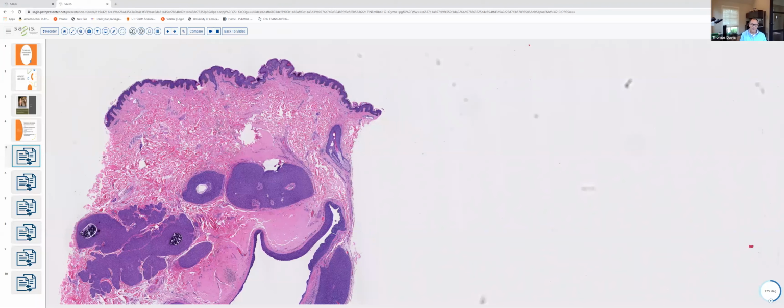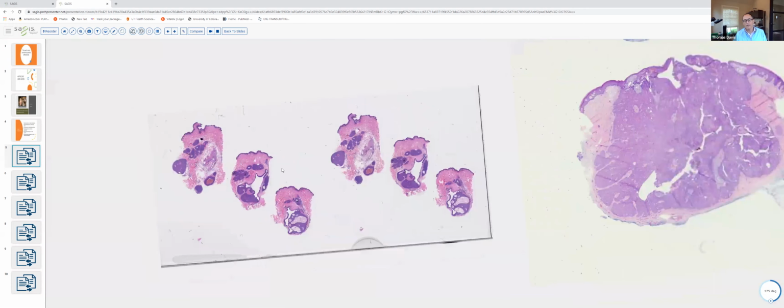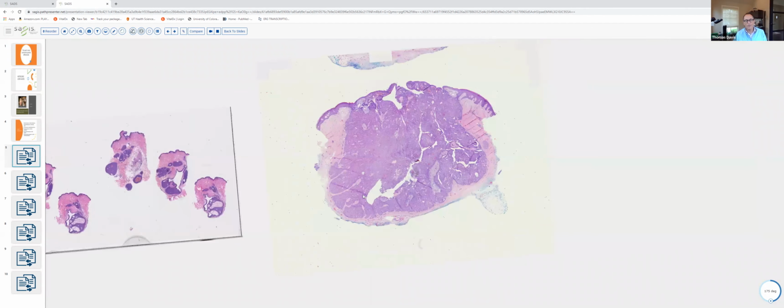And because of the monotony of the cellular population, jokingly, we refer to these tumors as boromas because they've got extremely boring cytologic features, okay? So let's go on over and see how the nodular hidradenoma differs.